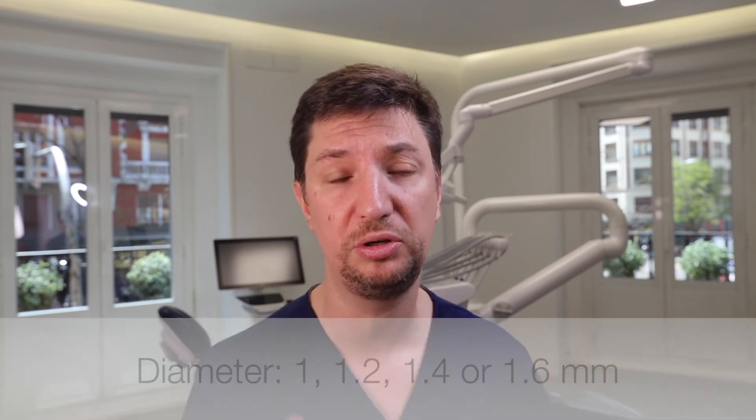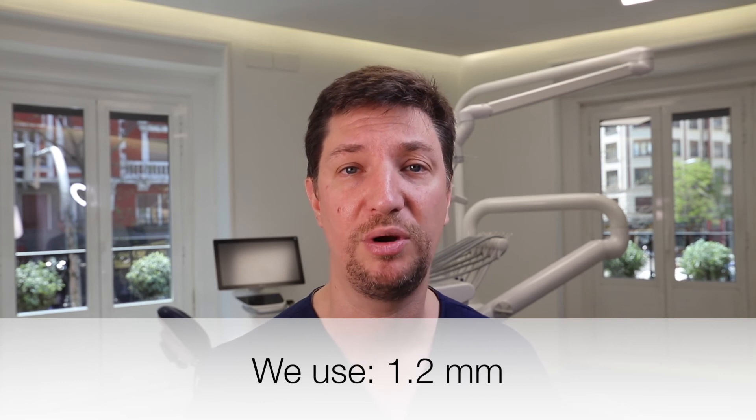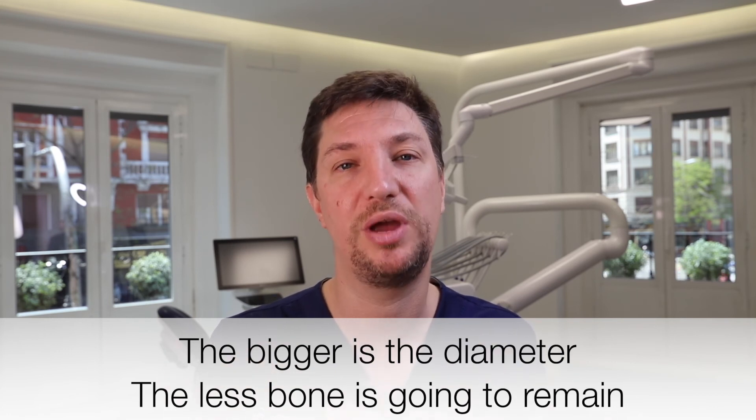We can also use osteosynthesis screws to immobilize titanium meshes. With a couple of very short screws — three millimeters — you don't even need to drill; in ten seconds your screw is placed. They grip the bone very firmly. Unlike pins that can sometimes pop out, screws are very difficult to pop out, making them a very good option for bone grafting. The diameters go from 1.0 mm to 1.2, 1.4, and 1.6 mm. We recommend 1.2 mm, which is enough to stabilize the bone graft. Going bigger means drilling a larger hole and leaving less bone.